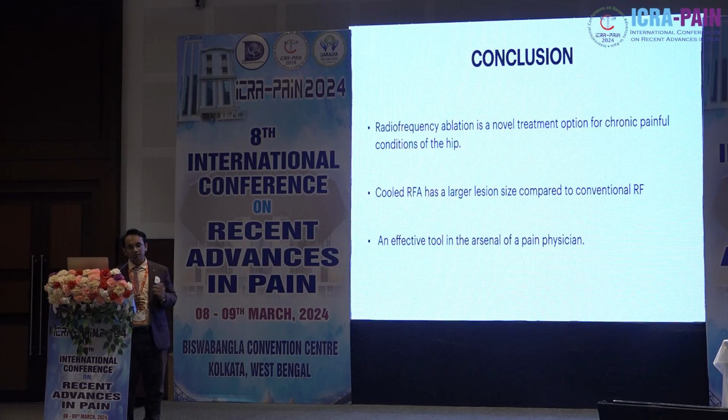So to conclude, definitely it's a novel treatment option for chronic pain conditions of the hip. Cooled RFA has a larger lesion size compared to conventional RF, and whichever one you are choosing, this is definitely an effective tool in the arsenal of a pain physician.